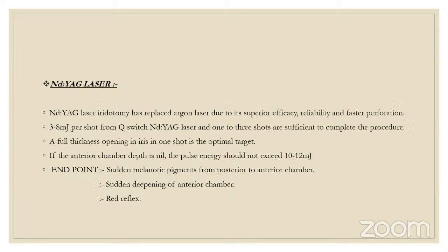With ND-YAG laser, iridotomy has replaced argon laser due to superior efficacy, reliability, and faster perforation. The energy is 3 to 8 millijoule per shot from a Q-switched ND-YAG laser, and 1 to 3 shots are sufficient to complete the procedure. A full thickness opening in the iris in one shot is the optimal target.